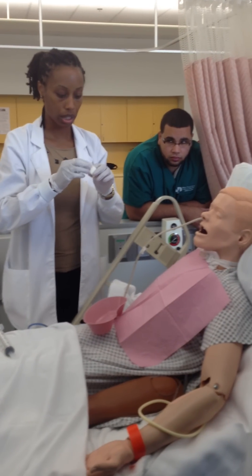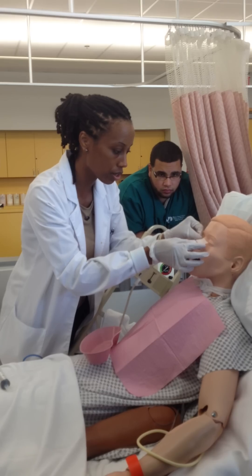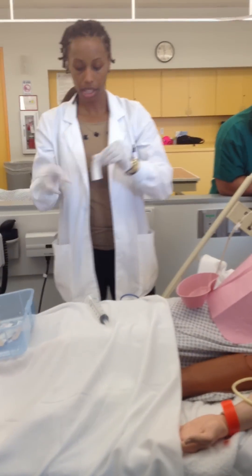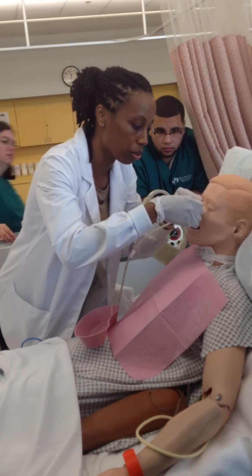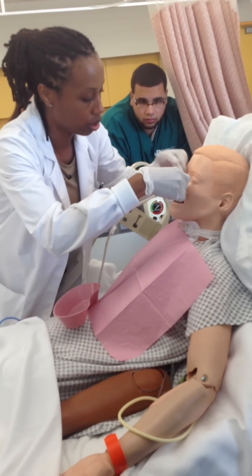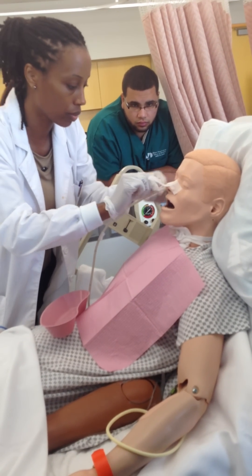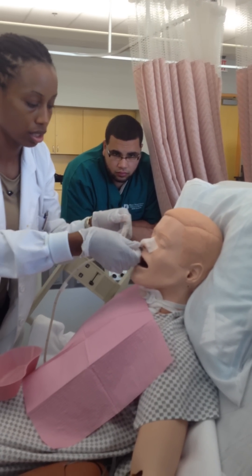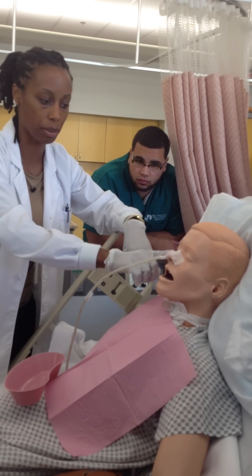So you want to take your tape and anchor it. Take a piece of silk tape and first go across the nose — just like that — creating a base for the tape. Then take another piece and tear it down the middle, not all the way. Go across the bridge of the nose, then wrap one side around and wrap the other side around the same way. That's anchoring the NG tube. If they accidentally pull it, it's going to pull this tape off but won't cause as much trauma, and it helps hold it down better.